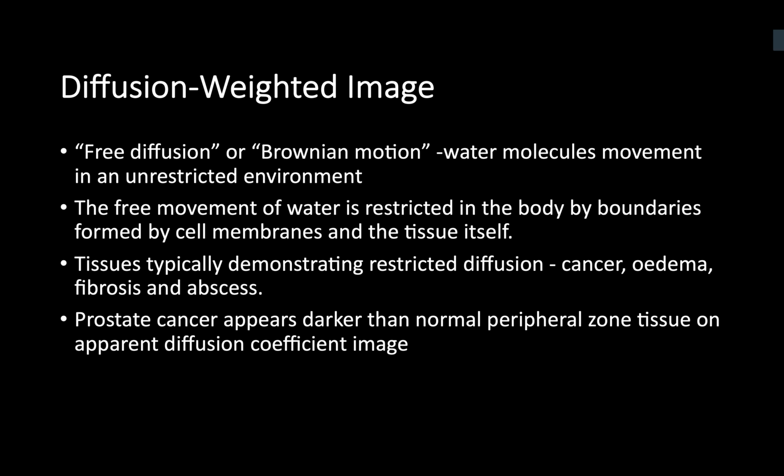Okay, well done. And what is the principle of diffusion weighted imaging? So diffusion weighted imaging works on the principle that prostate cancer cells are hypercellular and disorganized, and so the diffusion of water molecules is limited within prostate cancer cells as compared to normal cells, where you have better diffusion.